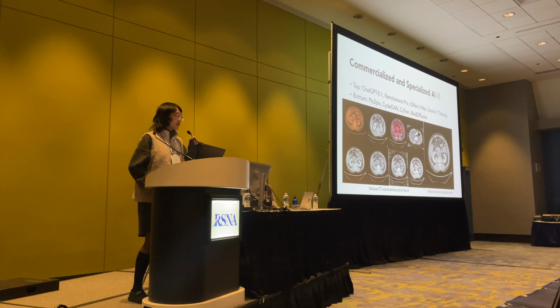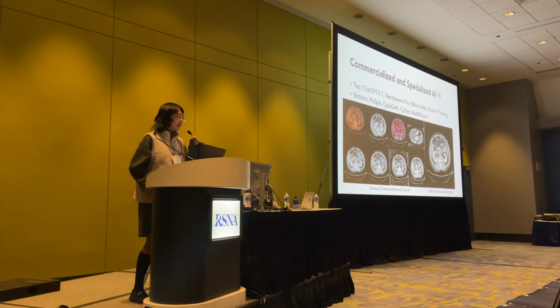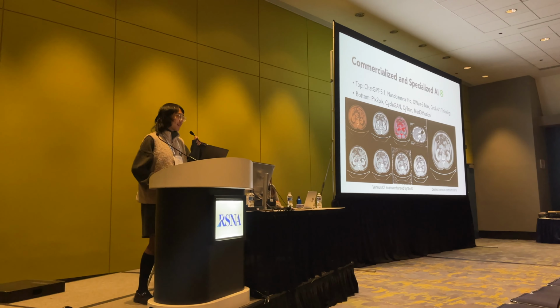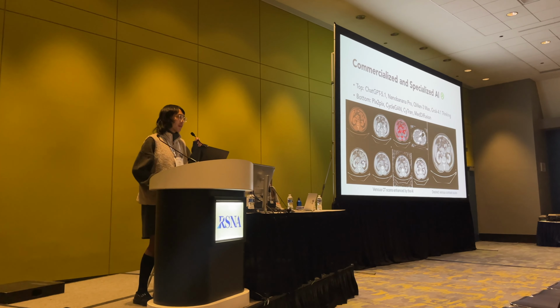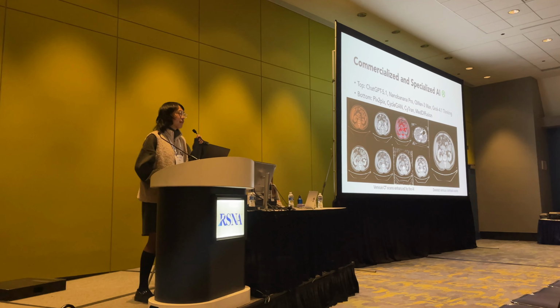At first, DeepSeek is not trained with medical-specific data. So to ensure a fair comparison, you cannot introduce something that doesn't know that at all to compare with this medical-specific model for the enhancement domain. So here, the DeepSeek family is not involved.